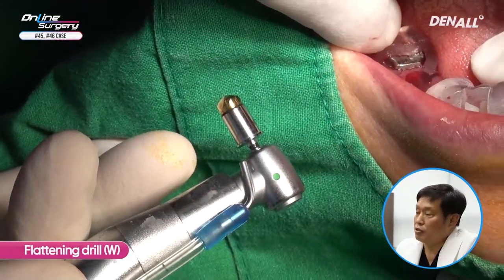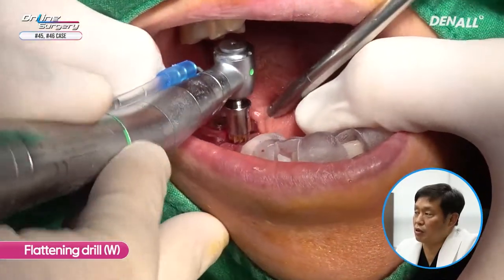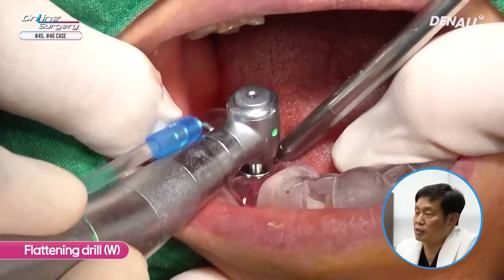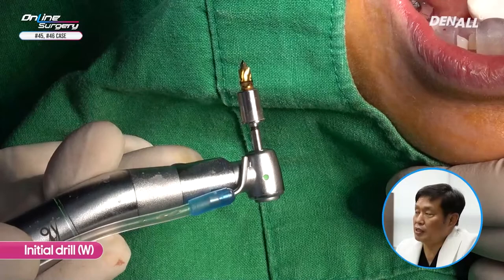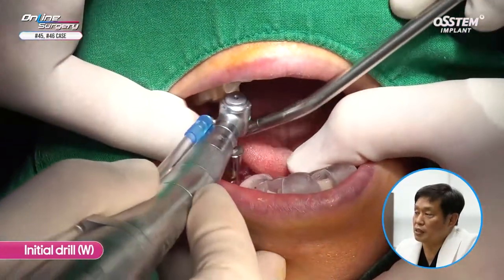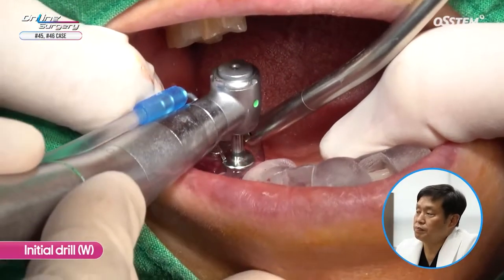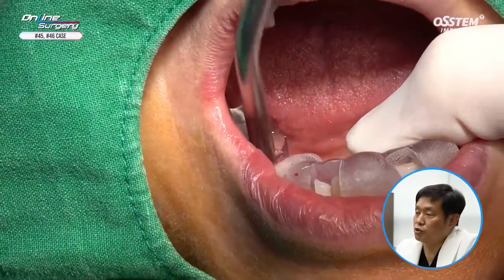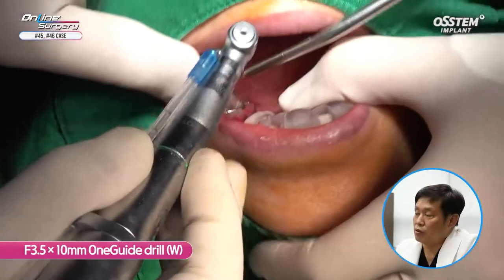In number 46, the flattening drill was used first to even the uneven bone in the superior portion. Initial drilling was done with the wide type in gold. Full length drilling was done, and the 3.5 by 10 mm OneGuide wide ball type was used.